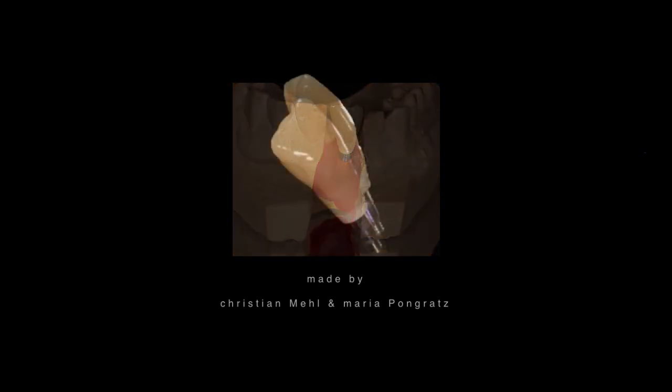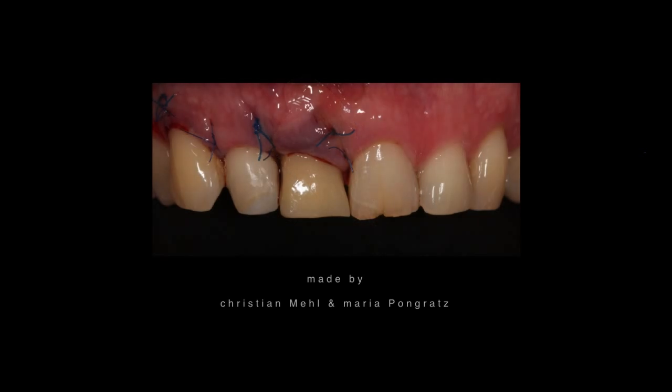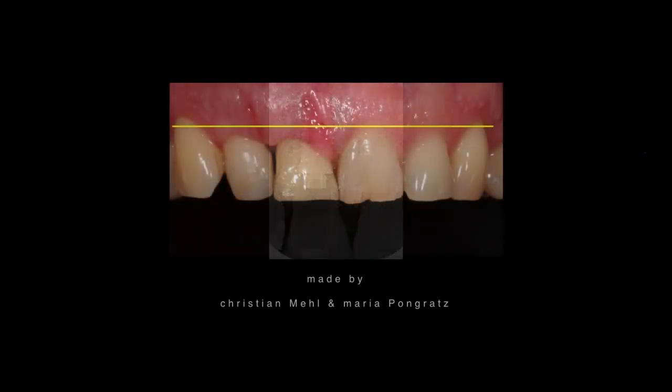Of course, we will do everything not to cement the temporary, in order to avoid any cement rests, and screw retain it on the placed implant. Important is that the implant has a torque of 35 Newton centimeters, the minimum. Then place the temporary into the situation, temporary filling on tooth 1, 2 as well, and seal it with sterile Teflon bands and Tetric Flow filling buccally.